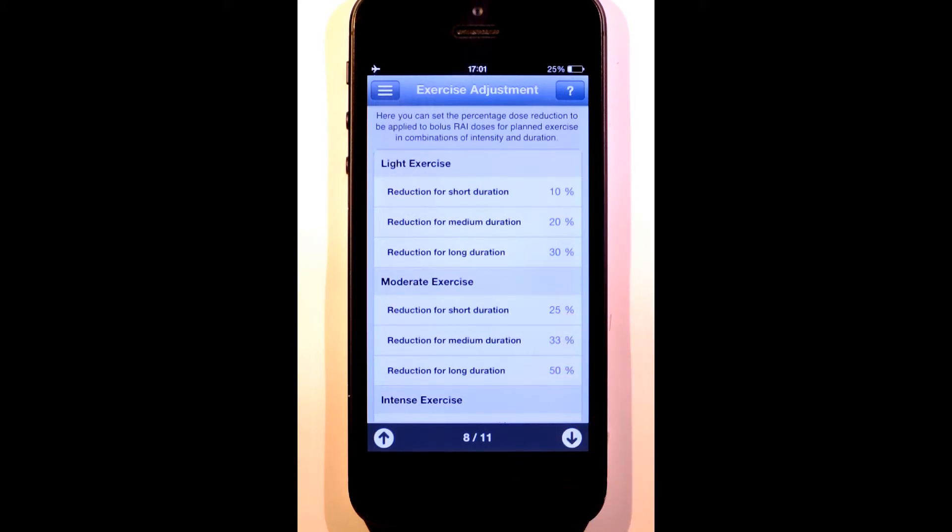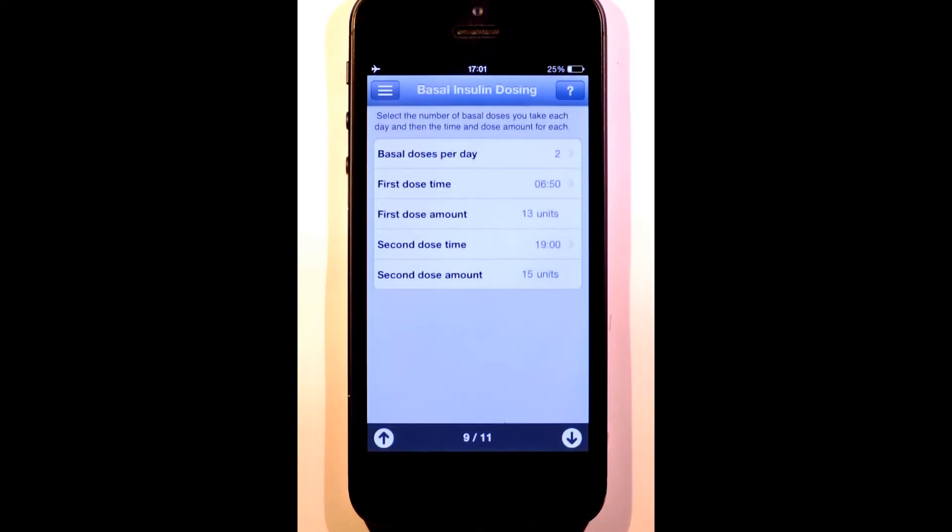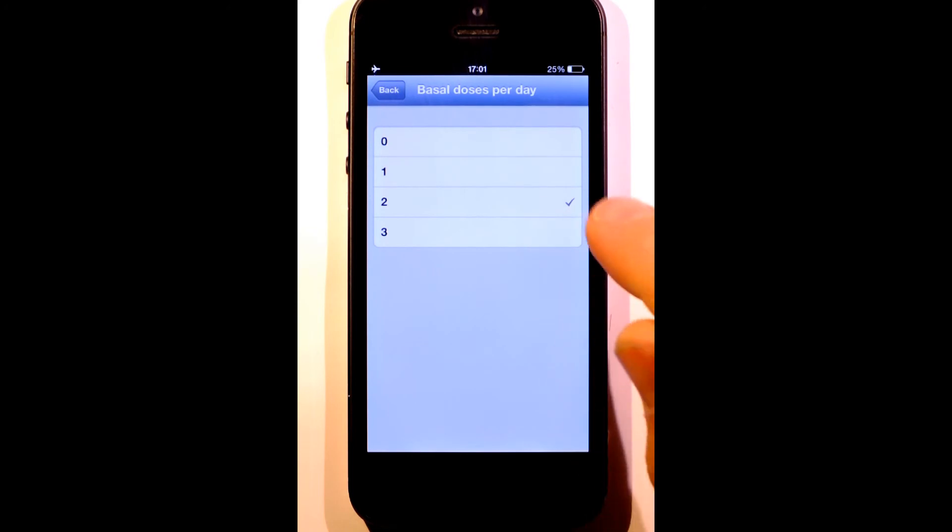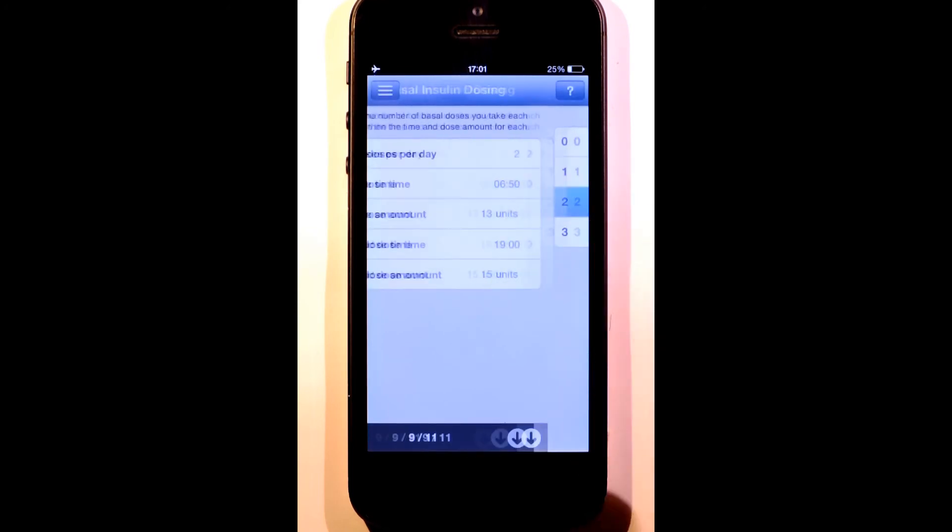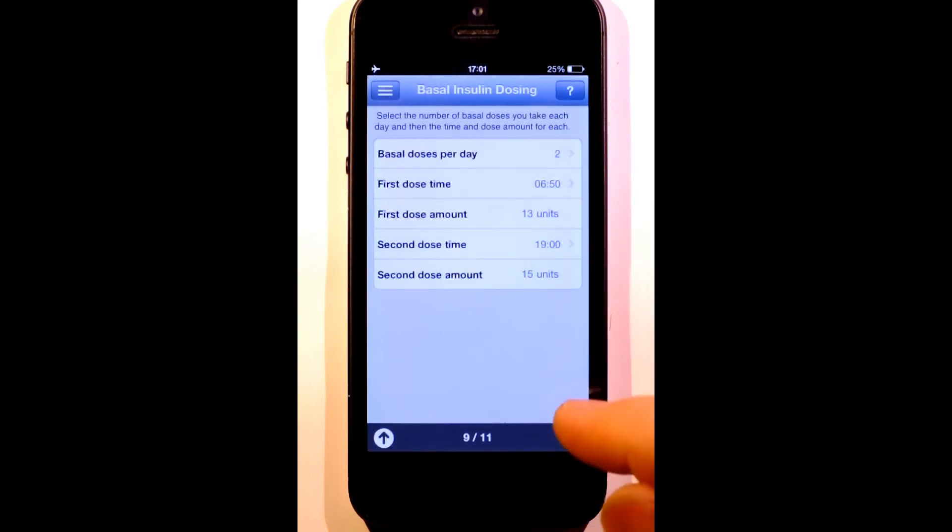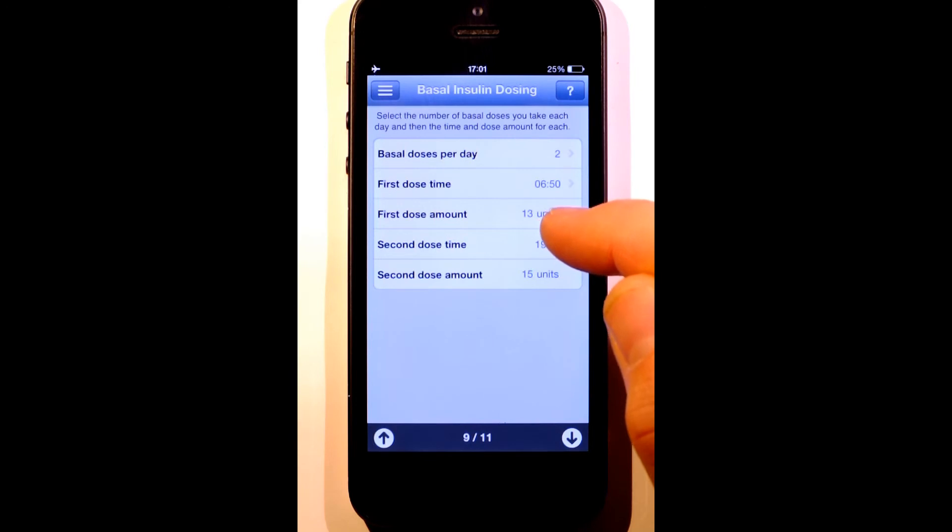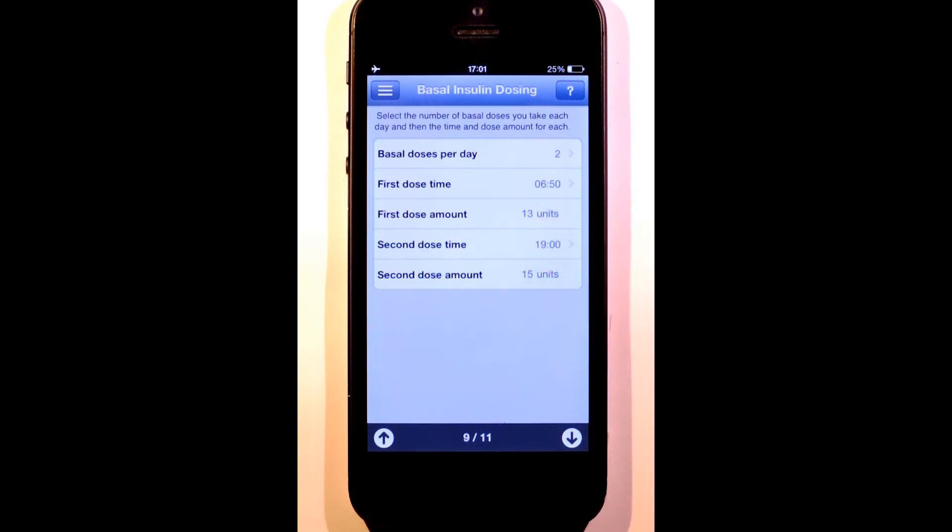We'll now move on to the basal dosing. I can set up 3 basal doses per day. I can set the time and the amount for each. If I open RapidCalc when a dose is due, I'll be taken straight to the basal dose screen with the scheduled dose preset. All I have to do is dose and save the record.